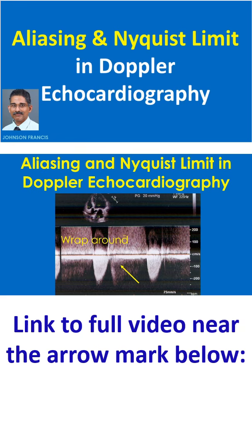High pulse repetition frequency Doppler recording showing aortic regurgitation jet above the baseline with a cutoff at the upper end and a wraparound seen below the baseline. Here aliasing is seen because the limit has been set just above 200 cm per second while the velocity of the jet is higher than that.